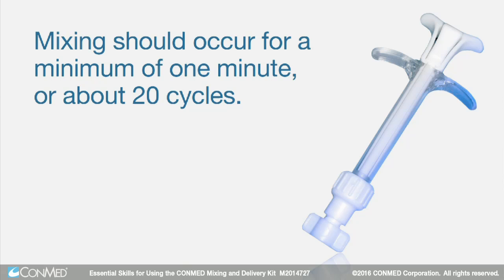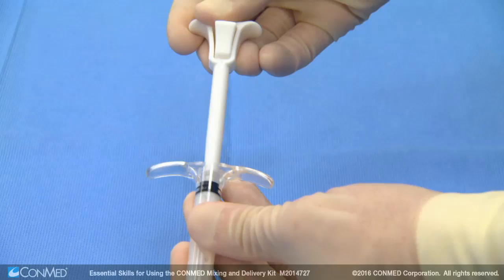Mixing should occur for a minimum of one minute, or about 20 cycles, until the material is fully rehydrated and completely incorporated. Next, pull back the mixing element to the starting position and reattach the push rod.